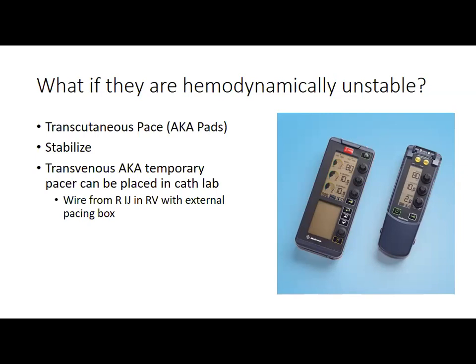Transcutaneous pacing hurts. Most of the time patients are dying if they need transcutaneous pacing, so they're pretty out of it anyways. If someone is still with it and they are being transcutaneously paced, whether or not to give them a mild sedative is kind of debated. For the most part, you would want to do it, I think, but not if it's going to make them hemodynamically unstable. So maybe a little Precedex, maybe some Ativan would be great. Anything stronger, maybe hold off.